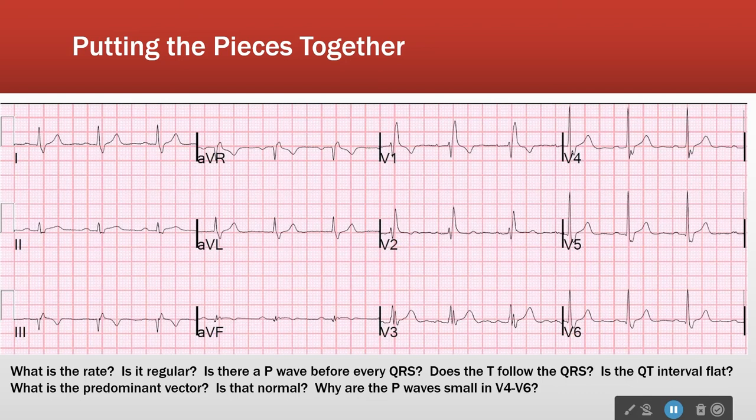So the classic one is what we call atrial fibrillation. In atrial fibrillation, the atria are kind of quivering. They're not really contracting in a pattern. They're just kind of quivering. So what we see in the ventricles is instead of the ventricles beating very regularly, they beat and then beat and then beat and then beat and then beat and then beat. You see how that is not a regular rhythm? Okay, so that's the second question. Is it regular? Is each heartbeat coming at about when you expect it to? All right? So that's question number two.